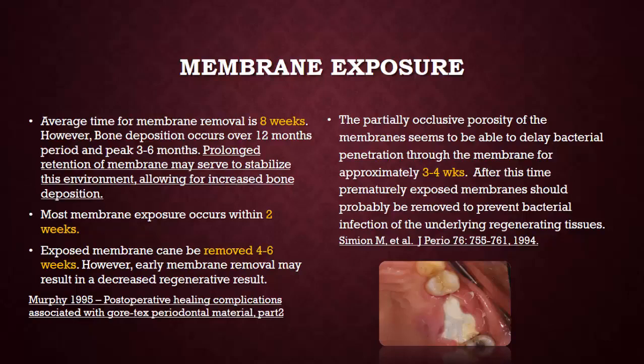However, when the edge of the membrane gets exposed, this will allow the epithelial cells to go underneath the membrane and also allow the bacteria to go under the membrane. So at that time, membrane removal is recommended.